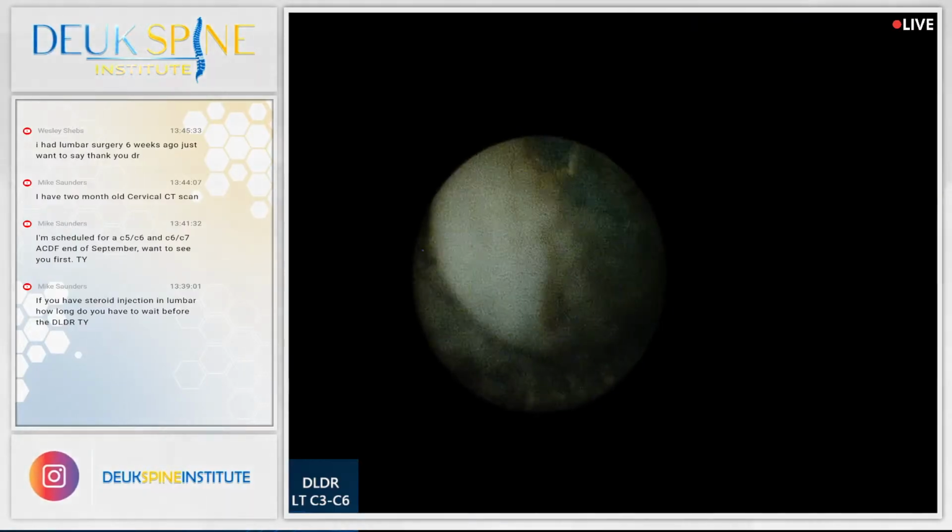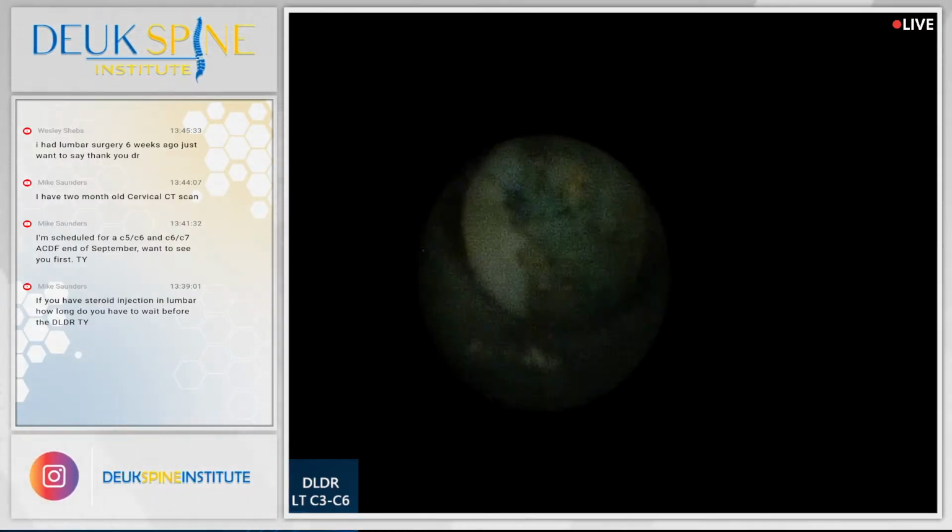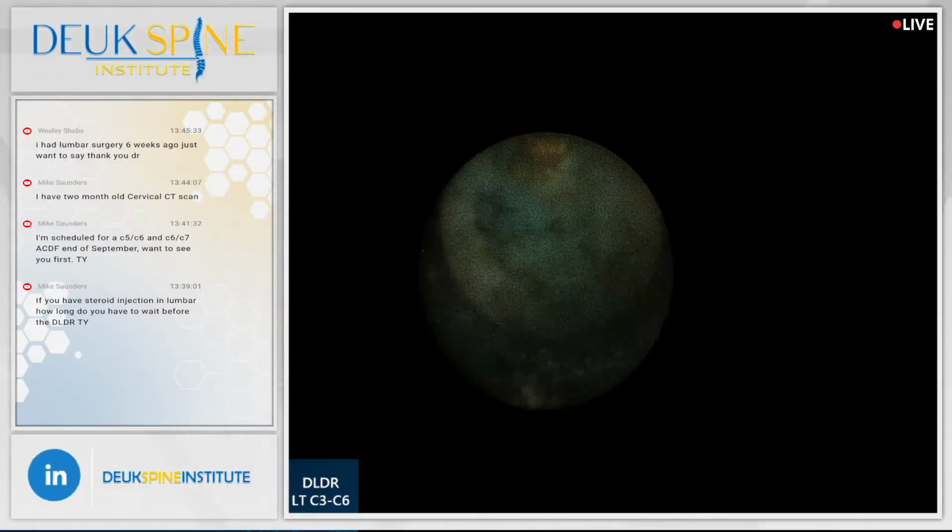All right, just about done. Then we're going to move on to the second disc out of 3.